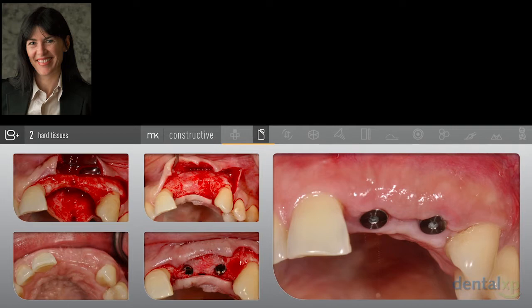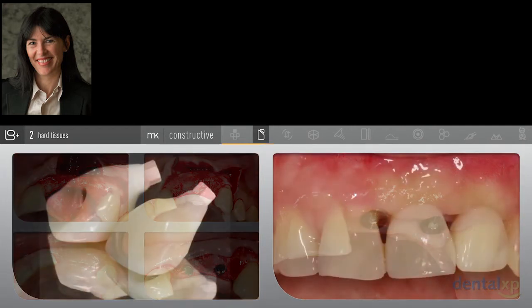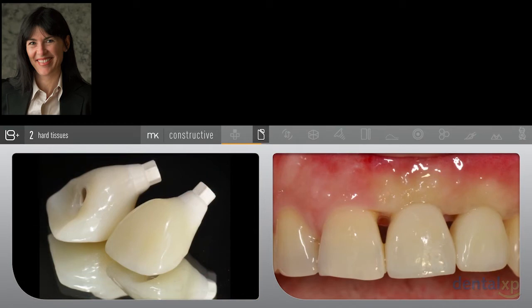But I certainly will tell you that the more cases that I'm doing side-by-side implants, even with elegant designs that control bone, even with good surgical technique, even growing bone back to the most robust I possibly can, the outcomes are rarely good. And when I look at this, here you're looking at delivery of provisionals post-integration, and you see I'm going to start the sculpting process for my soft tissues. I have some major soft tissue deficiencies that I'm going to be dealing with.